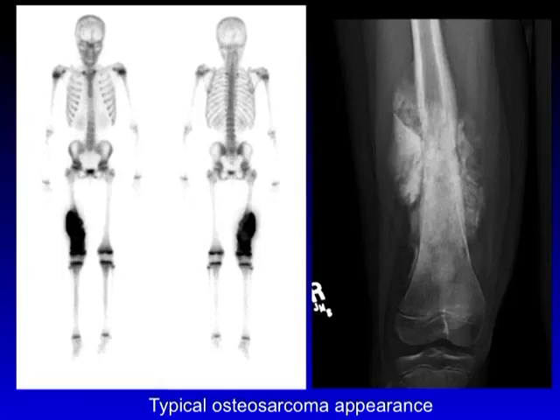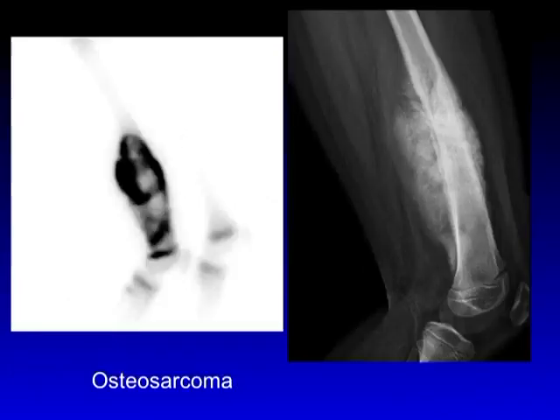That enchondroma diagnosis would be at the top of your list. For contrast, here is what an osteosarcoma looks like — a kind of ugly-looking lesion on bone scan. Note the bone scan uptake really mirrors the appearance on the plain radiograph. You've got intense uptake in the tumor new bone formation, not just bone remodeling. Osteosarcoma really stands apart from other tumors because that osteoid-producing intense uptake can be seen in soft tissue metastases. This is the classic appearance of an osteosarcoma.